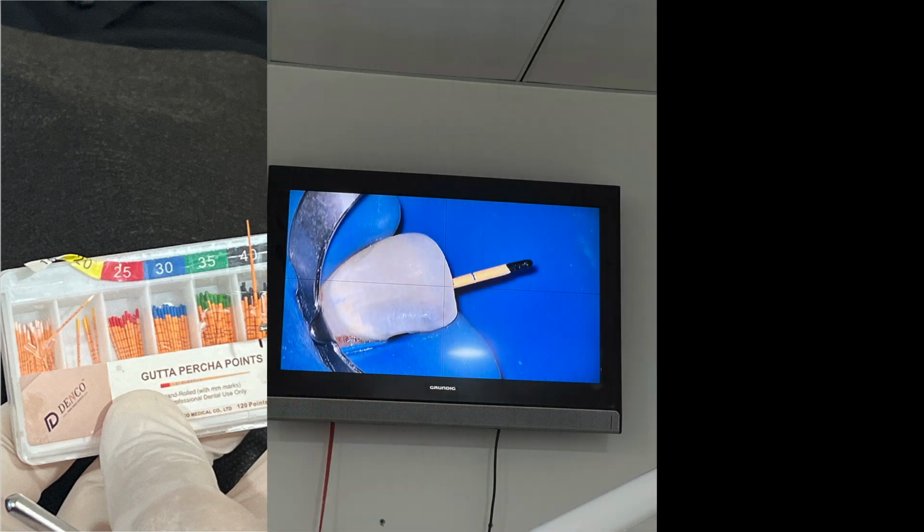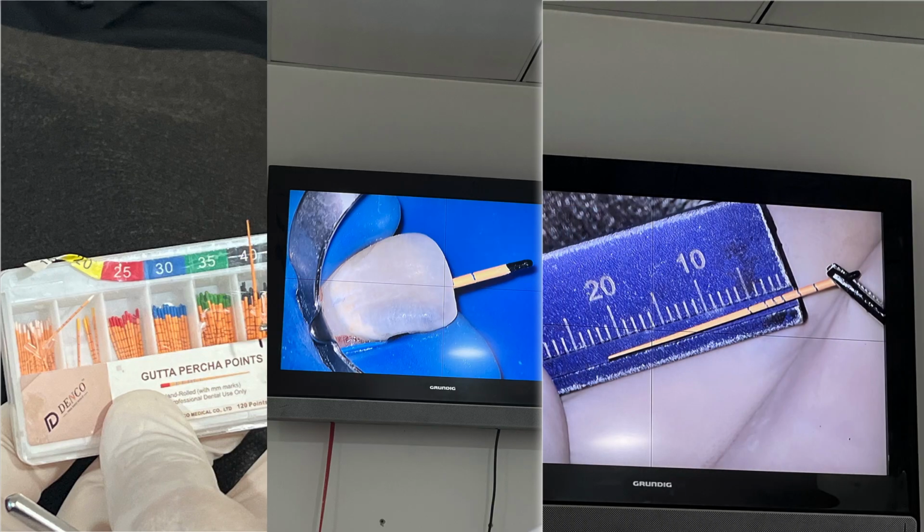So the next step is that I am choosing a guttapercha from the taper 2 hand type guttapercha. Absolutely, in this case I know that sizes 15, 20 and 25 mostly are going to go over, but I am checking every size. So I realized that size 40 taper 2 goes to the full working length, which is 22 millimeters. Okay, so this is the same guttapercha that I took, and this is the working length that I am checking.